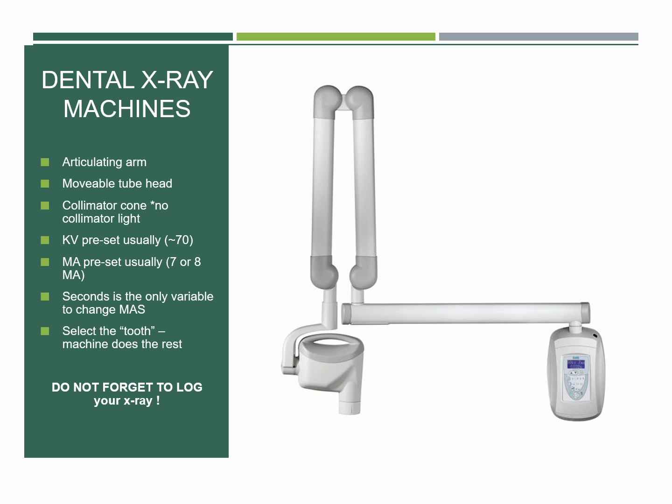Okay. We're going to have this conversation right now because it happens every time, and Kathy and I will be on your case after you practice because we're going to do a series of runs of practicing on skulls this semester to practice with the machine, and invariably everybody always forgets to log, right? So you've got to still log them. They still count as x-rays because x-rays have left the machine, so they have to be logged. We do have a separate dental x-ray log that you'll be filling out. Don't worry, we'll keep reminding you.